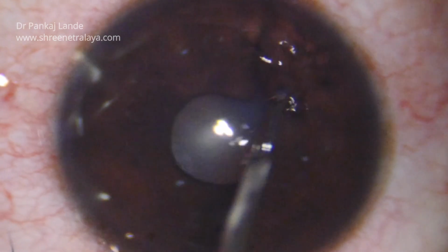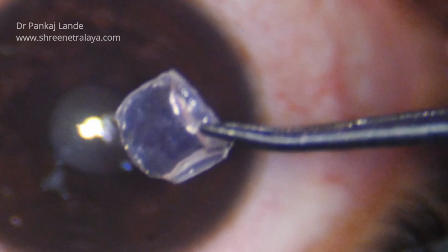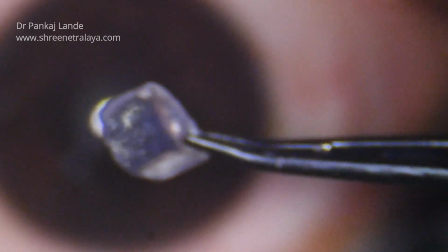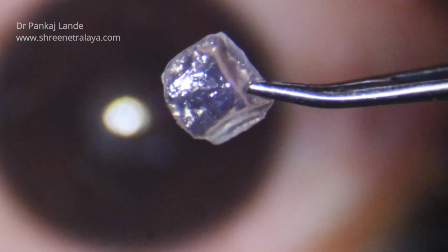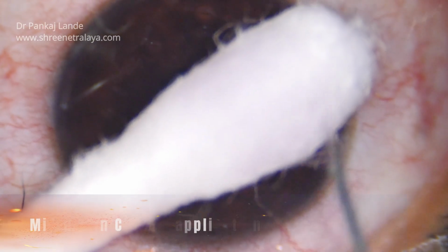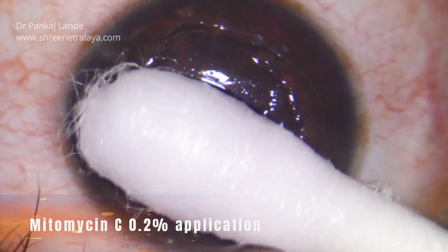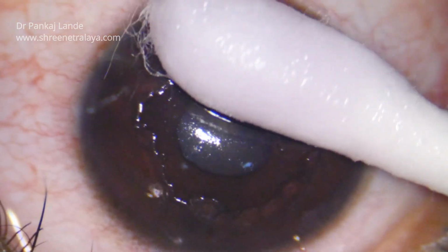Once the scar is dissected and taken off, now we have to take care to prevent the recurrence of the same scar again. To prevent the recurrence of the scar in future, it is crucial to use mitomycin in such cases. I am using a freshly prepared mitomycin on a cotton swab for 15 to 20 seconds once the scar is dissected. Carefully wash off the mitomycin with 20 to 30 ml of saline for the next 2 to 3 minutes.